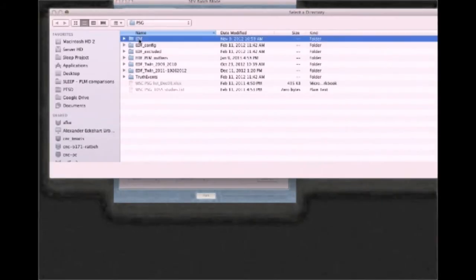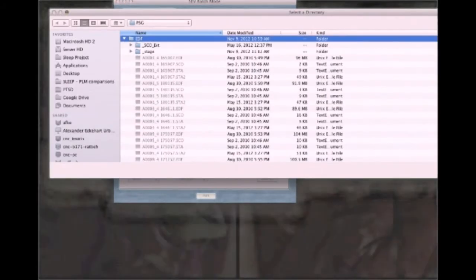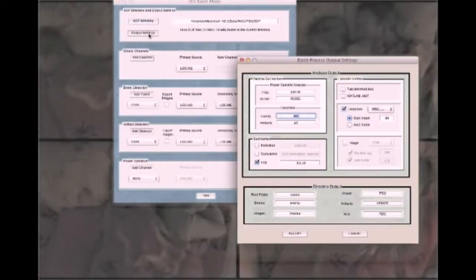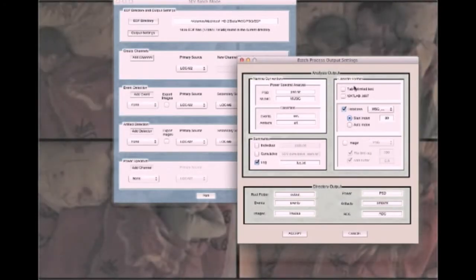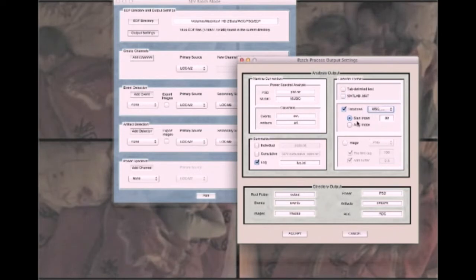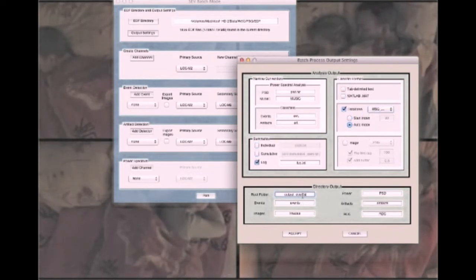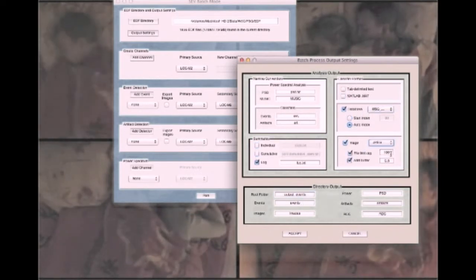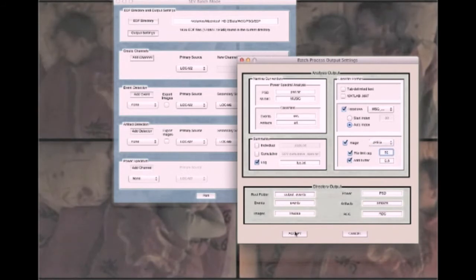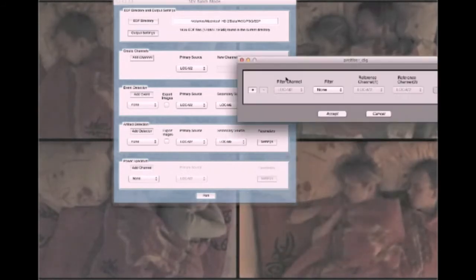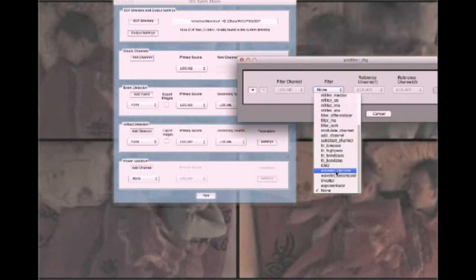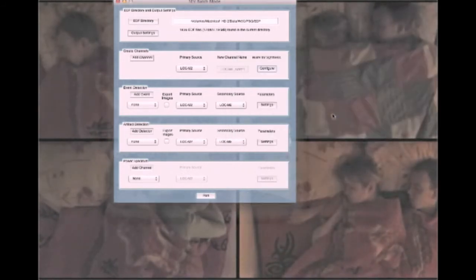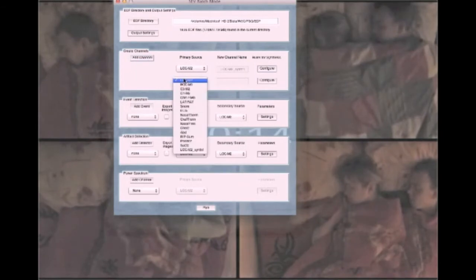Examining individuals on a case-by-case basis is helpful, but so is examining sleep on a population basis, and the SEV's batch mode sets it apart from anything else. Here, a cohort of over 2,000 patient studies is being configured for processing.